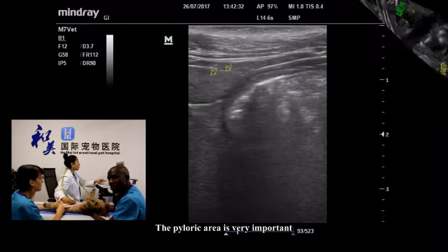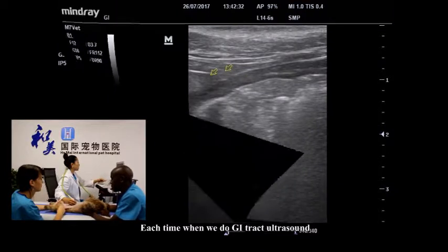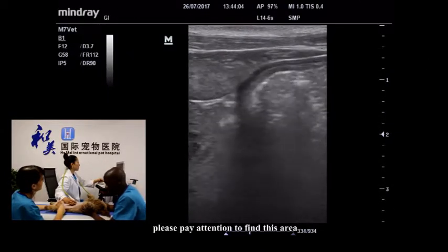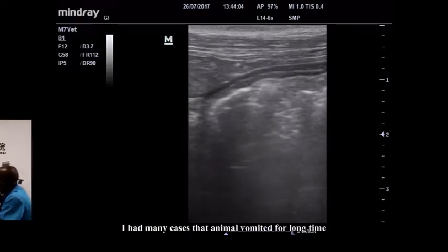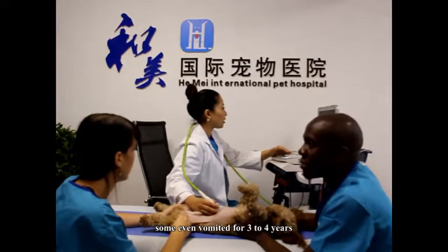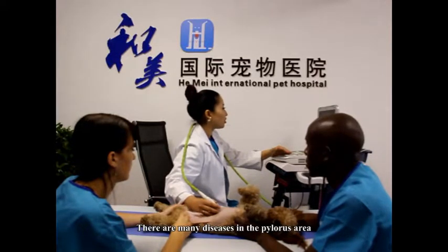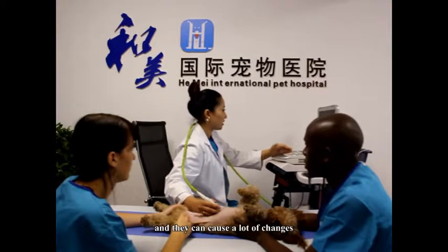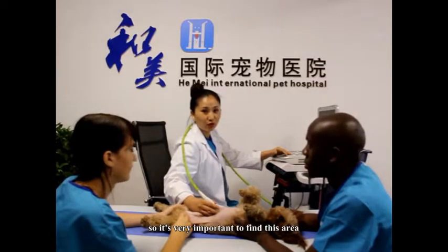The pylorus area is very important each time we do GI tract ultrasound. Please pay attention to find this area, especially for animals that vomit. I have many cases that vomited for a long time, some even for 3 to 4 years, and when I did the ultrasound, I found a big tumor on the pylorus. There are many diseases in the pylorus area, and they can cause a lot of changes. So it's very important to find this area.